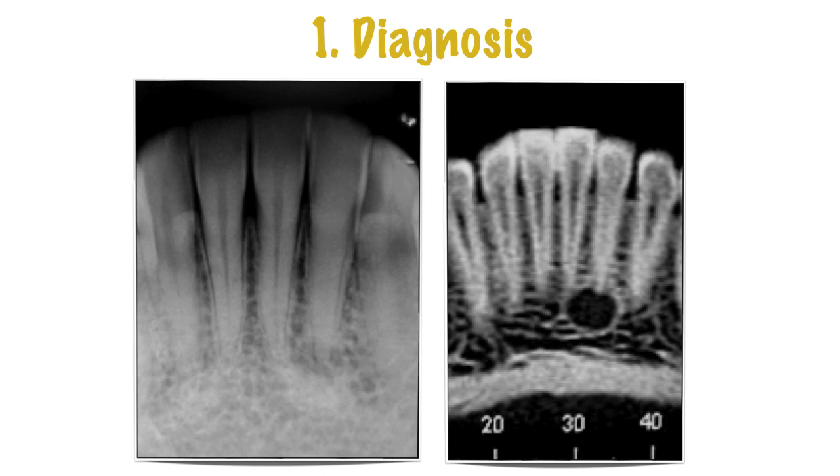Not only that, but treating this tooth here with this calcified canal is extremely difficult. It is a very narrow tooth, so if you miss your alignment along the axis of the tooth, you may perforate the tooth. So the CBCT scan will help with the diagnosis, but will help with treatment as well.